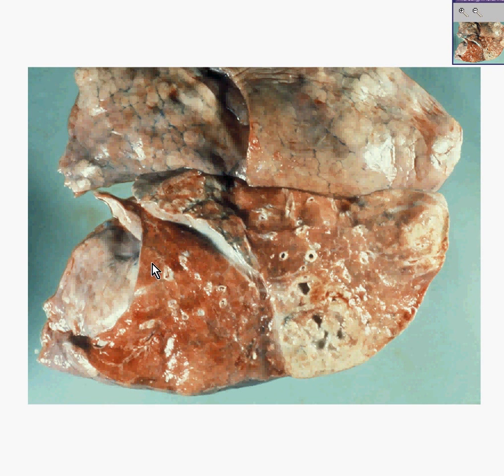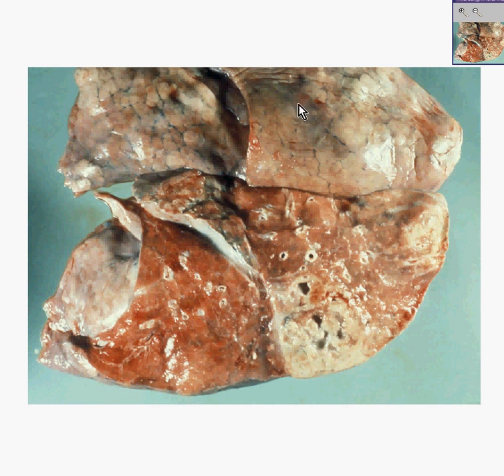Here is another lung. Notice here's the pleural surface, here's a cut surface, here's some more pleural surface. Here is some fine subpleural stippling by anthracotic pigment, which is very common, almost to the point where I could say it's normal.